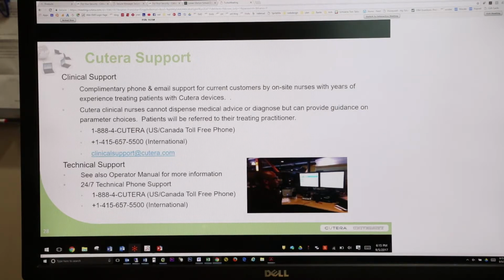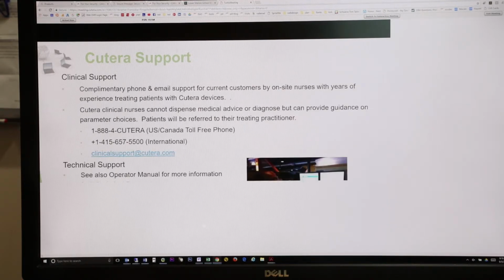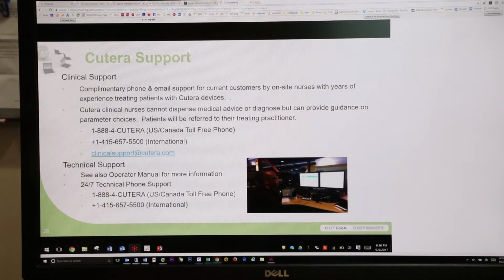They will notice a difference right away if you follow the guidelines and put in the amount of pulses that are necessary. But people will also report a smoothness, a firmer and fuller appearance. Now, it's not going to appear from the very first treatment. Like I said, only the mottled people will notice the difference because of the pigmentation.